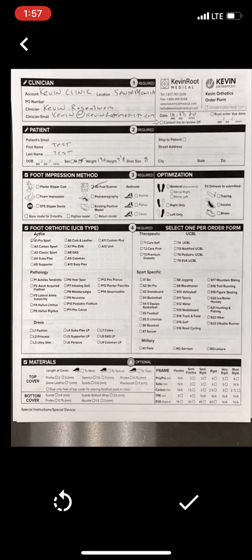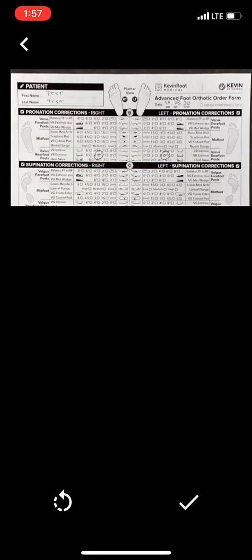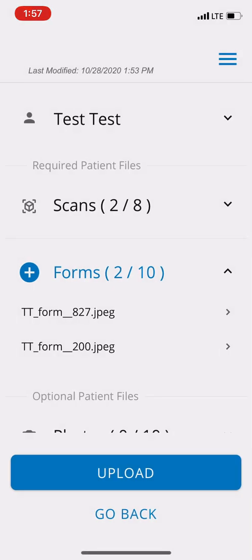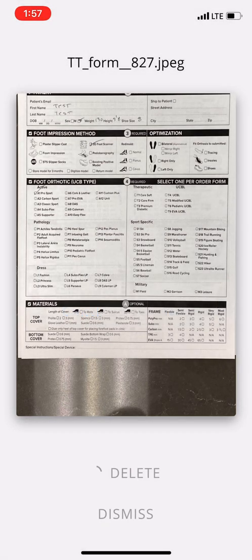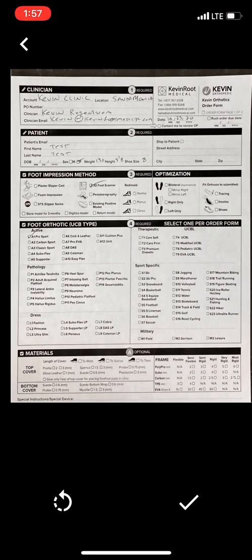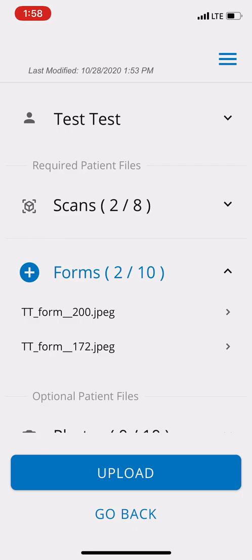Everything came in and that looks good. Let's add another form — it takes me right to the patient page. I'll hit the plus again and scan the second form. That didn't get everything, so I'm going to redo that — perfect, that looks good. Now let's look at the first form. It didn't look good, so let me dismiss and delete this first one. Let's do one more form. That looks great — I'm going to dismiss this. Our operators will get these and be able to understand what's needed.